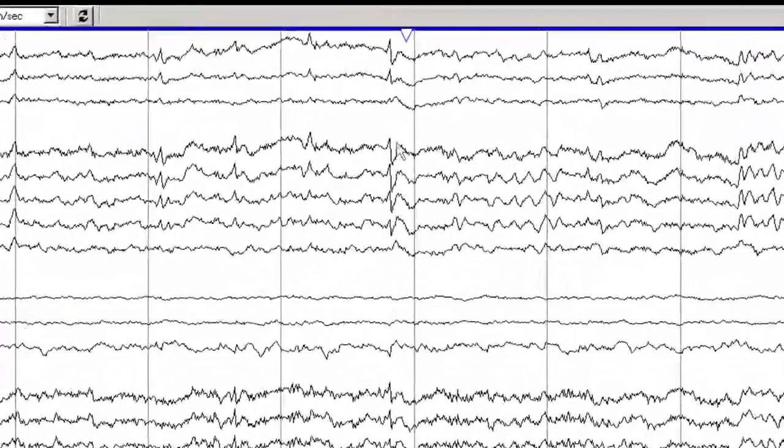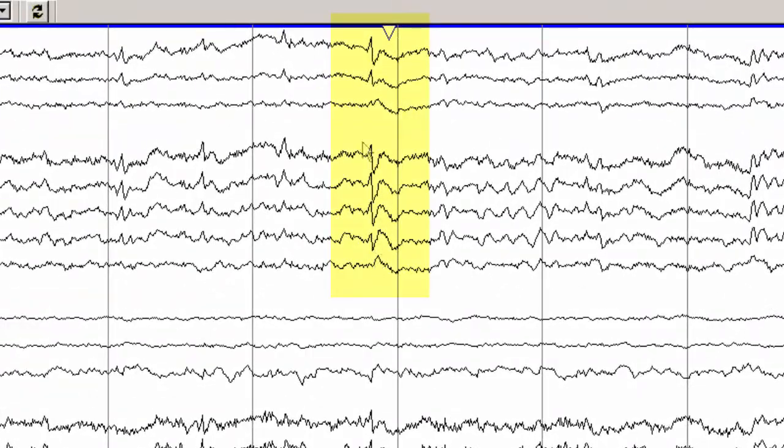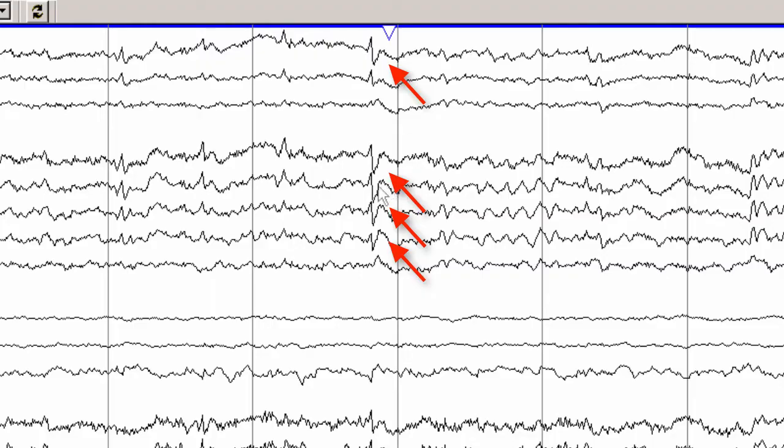This is a particularly good example of a small sharp spike, again with the broad field best seen in an ipsilateral mastoid montage, and with a low voltage slow wave following it.